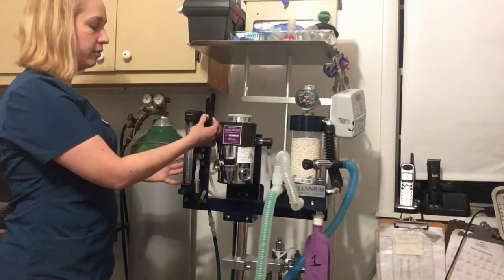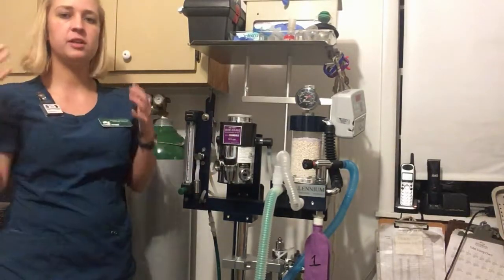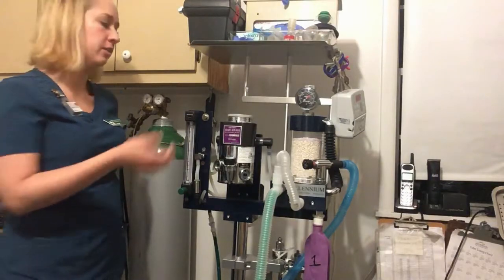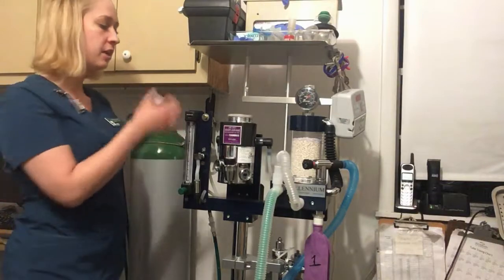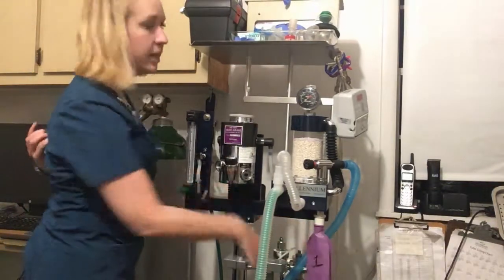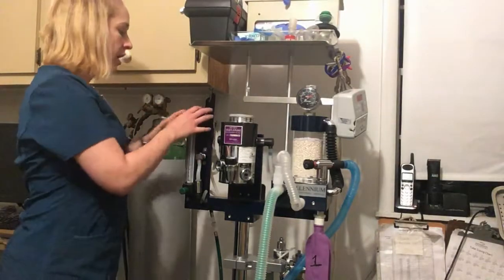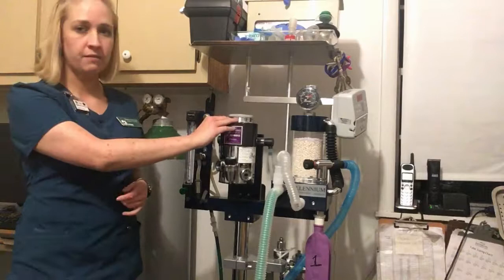This is going to be your flush valve as well. You can flush the system with some more oxygen. One use for that is to flush the oxygen out of the system when you're turning the oxygen off at night, or if you're trying to fill up the bag to manually get the patient to breathe.